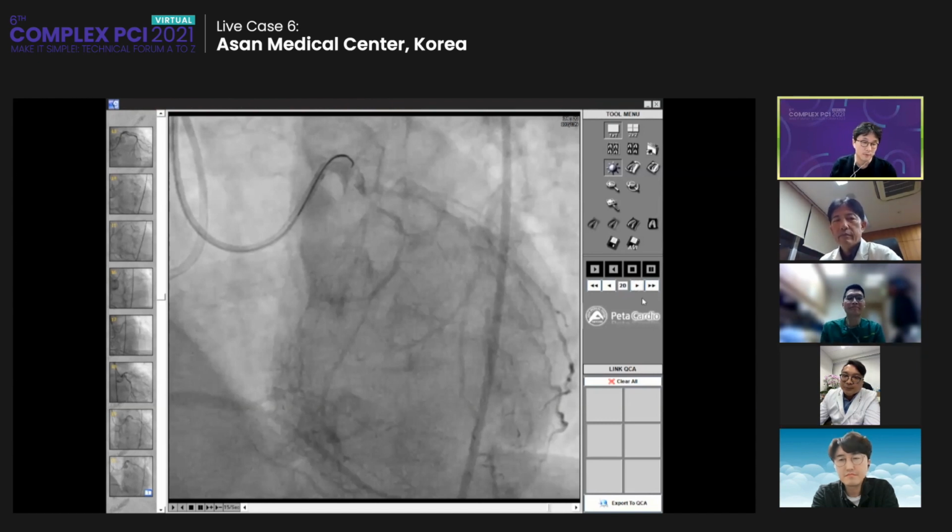Yes, I think you mentioned a very important point, because now we have the information of CT and our angio, and looking at the previous angio, I thought that the main reason they failed was that they did not prepare thoroughly, as Dr. Muramatsu mentioned. And also, I think they failed to insert the wire at the appropriate point. They just used the workhorse wire without any microcatheter support. They did not try to locate the exact point of entry. And after an inappropriate position of the wire, it's very hard to overcome the whole process.